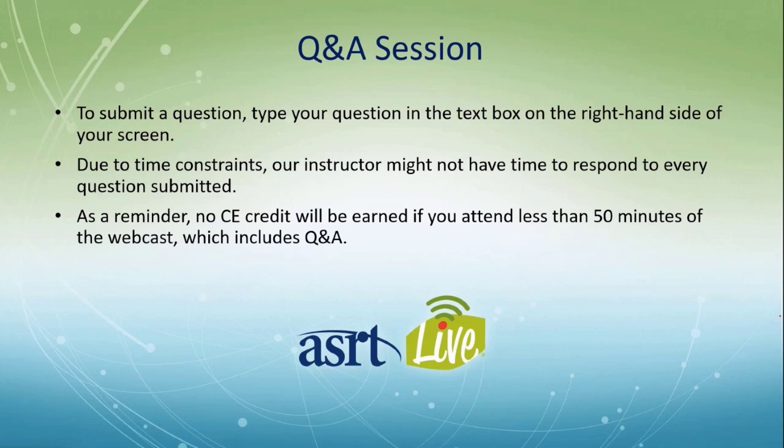And something that's been really confusing is that people tend to say, well, we have to increase mAs in order to get more exposure to the detector. But why isn't it true that higher kVp also gets more exposure to the detector because of increased penetration? Either one can be used to increase detector exposure, and either way, you're helping to reduce mottle. So with increasing kVp, we can make an argument that it actually may help prevent mottle. And a lot depends, as we said, on the patient anatomy.